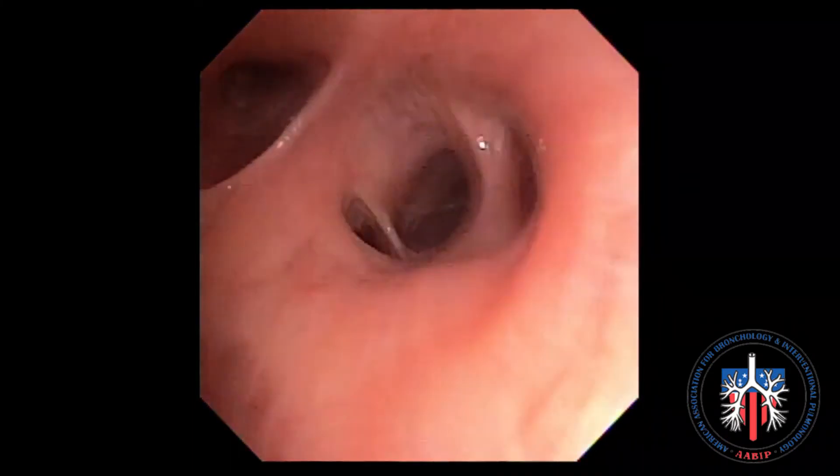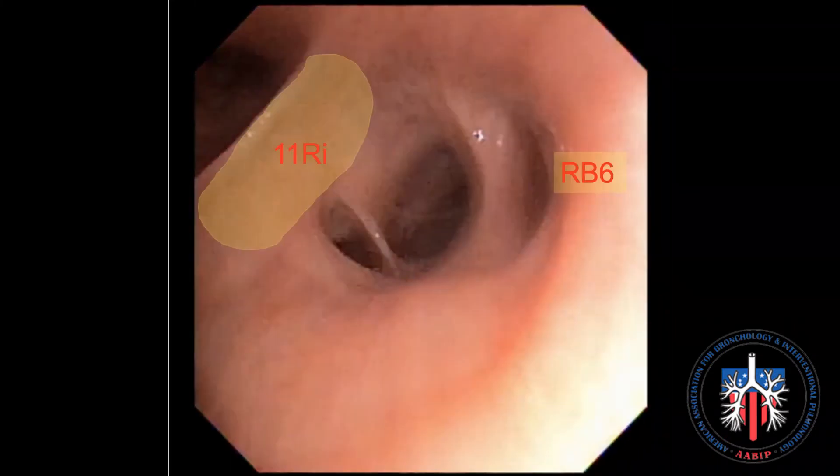The right interlobar node, or station 11R inferior. Drive the scope into the bronchus intermedius and towards the right lower lobe. The ultrasound transducer should be placed over the area shaded as shown here, just under the right middle lobe take off.